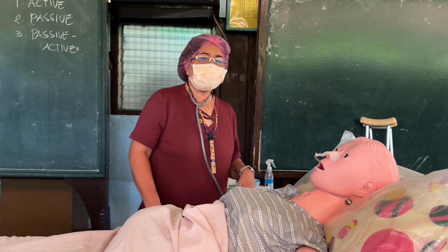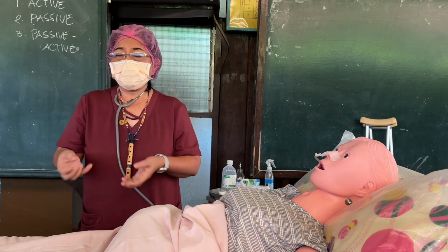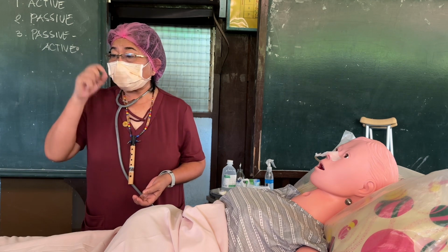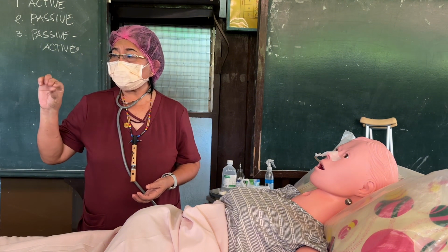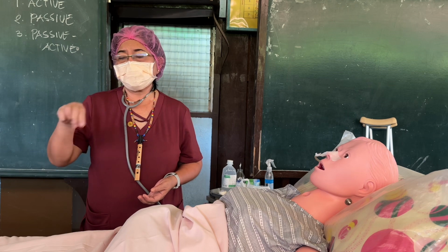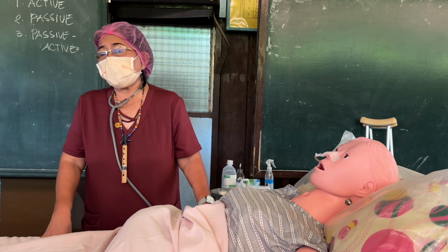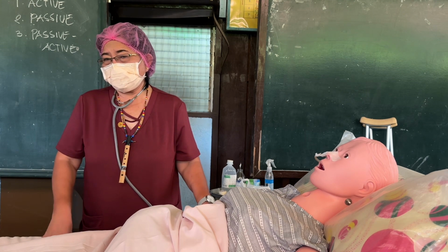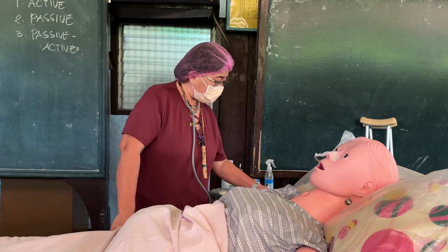And then, you prepare the meds ordered. For a capsule, you just open the capsule, put it in a medicine glass, then mix with 10 cc water. It should be well dissolved. If it is a tablet, it should be well pulverized. Now there is a tablet crusher, right? It should be crushed, then you mix with 10 cc water. Because if it is not, you will have a problem when you do feeding because it will clog the tube. The feeding might overflow. Okay, so we're ready.